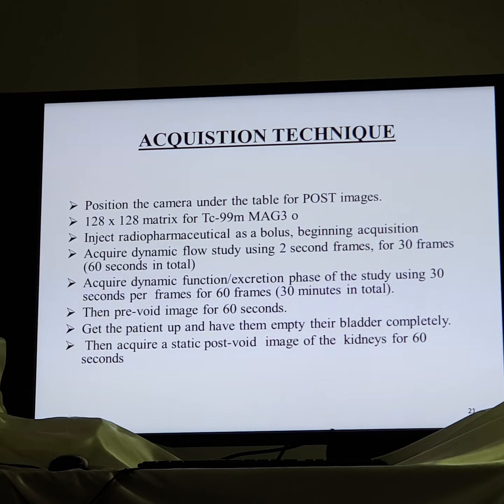Then immediately, we start the function, or what we call the excretion phase. Immediately after the flow ends, 30 seconds per frame for 60 frames. The total will be 30 minutes in total.